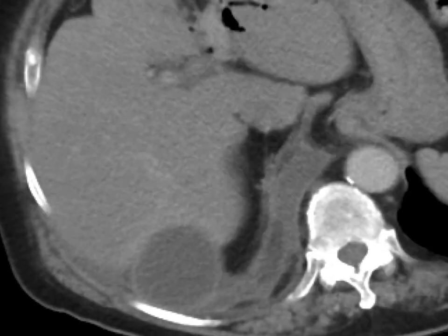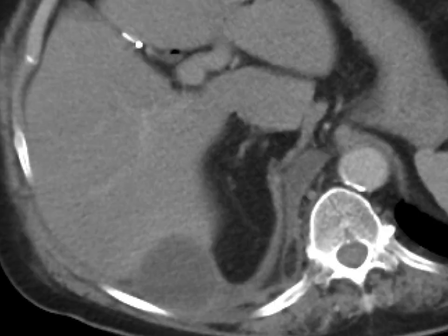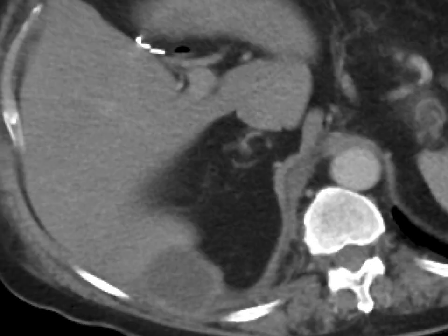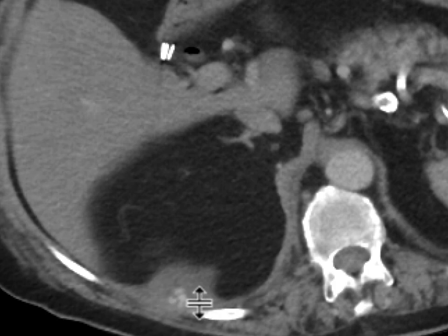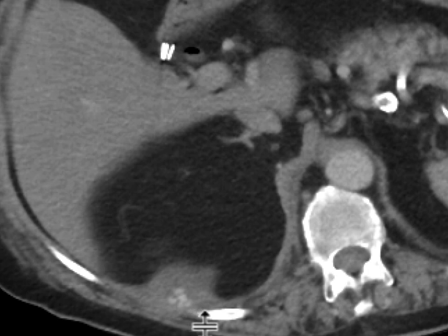As we scroll more inferiorly, we can see that along its dependent aspect, there are a few clusters of high-density foci, and they really do look like stones. They're very linear and round in shape.